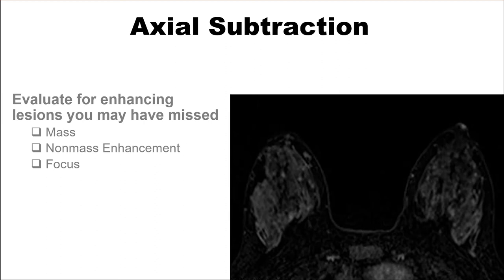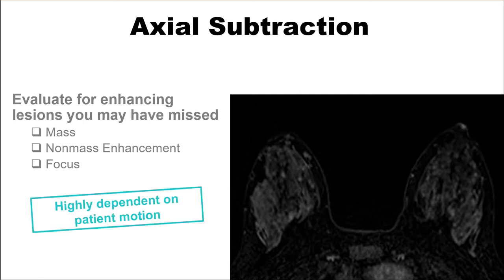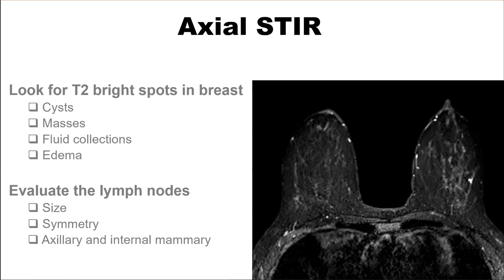Moving on to the axial subtraction sequences, look for any enhancing lesions you may have missed. Some people like to use the subtraction sequence up front. However, another approach is to use it at the end as a final check to ensure that you didn't miss anything. Remember, subtraction images are highly dependent on patient motion.